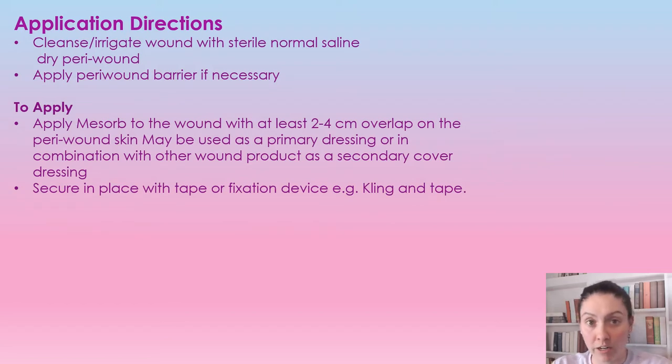Just like any wound care product, first we are going to cleanse the wound with normal saline and dry off the peri-wound tissue. You can use a barrier if it's necessary. To apply, you just want to make sure that the dressing is about two to four centimeters overlapping the peri-wound skin. It can be used as either the primary or secondary dressing, and then you're going to secure it in place with either cling tape or any sort of fixation device.